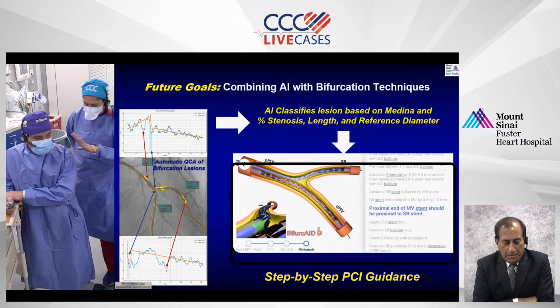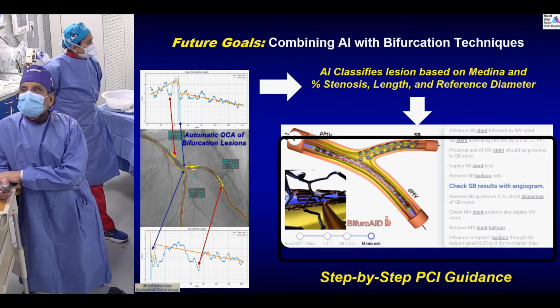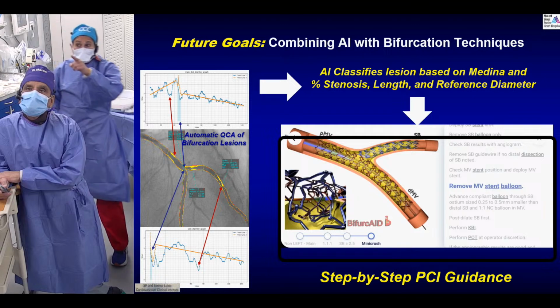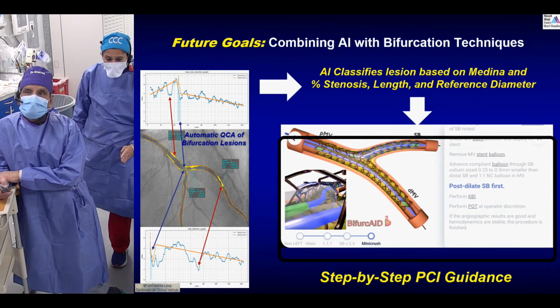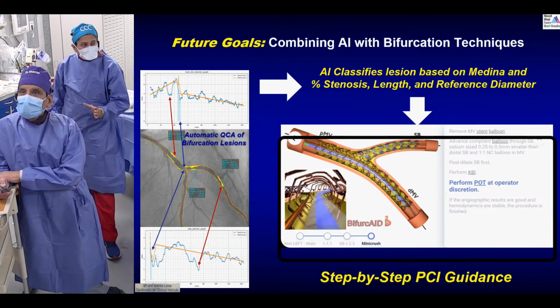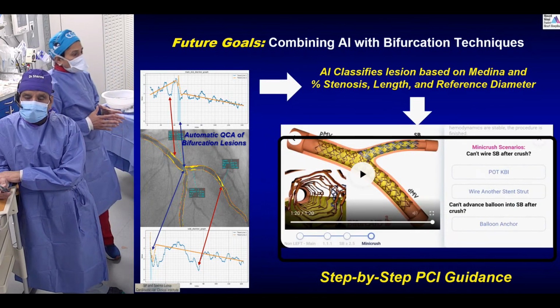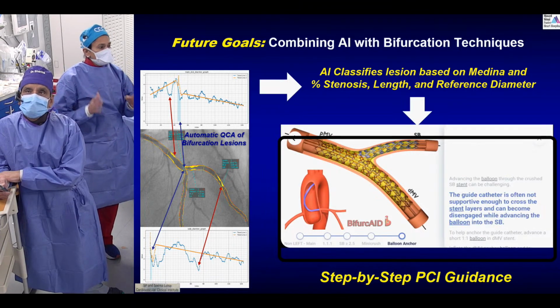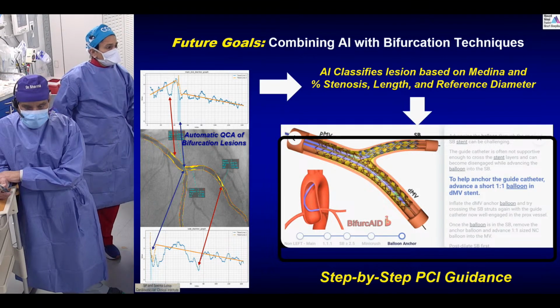Okay, let me just correct both of you. Once upon a time you needed millions of data sets. Currently, the computer scientists are so smart that the entire AngioQuant was done with 800 angiograms. That is what's called supervised training, whereas you are thinking unsupervised. In a supervised training set, with most of these computer scientists now doing PhDs in AI, you just need a few data sets that are 100% accurate, and that's how you come up with it. You do not need millions and millions of data anymore. Those days are done.